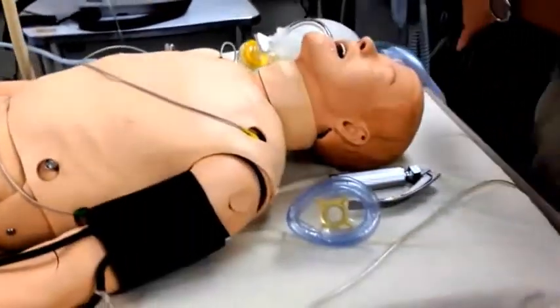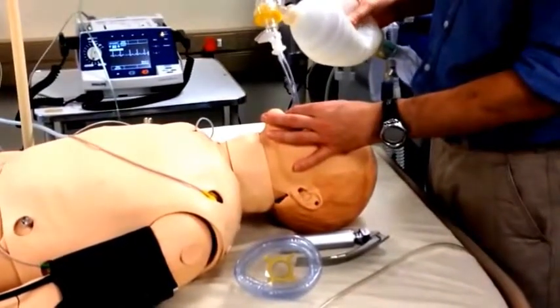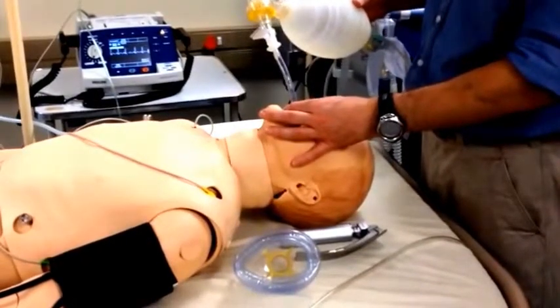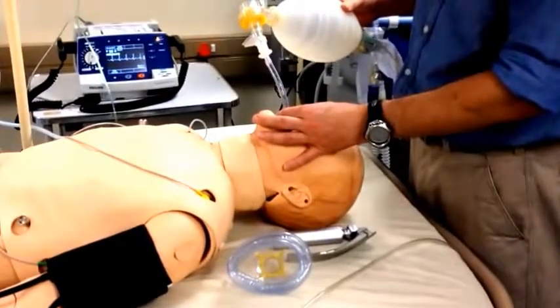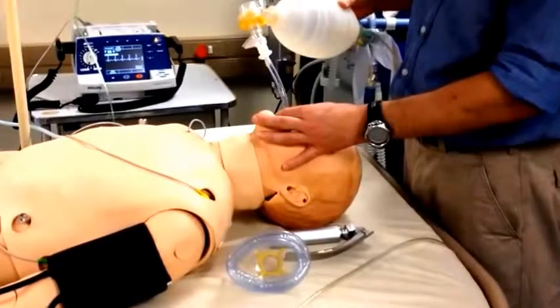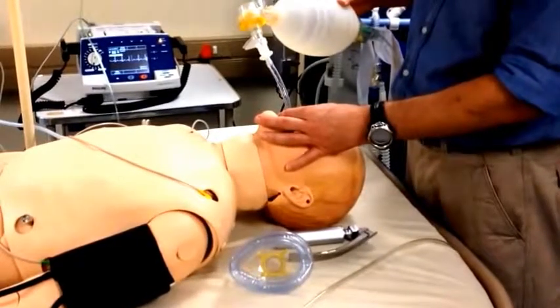If clinical confirmation and secondary confirmation show that you have had successful placement of your endotracheal tube, you can now secure the tube in place, connect your patient to your ventilator, and proceed with standard post-intubation care. There are many different ways to secure an endotracheal tube to a patient, including tape and tie techniques and commercial devices. I will now demonstrate one technique using a piece of tape that you tie in a specific way.